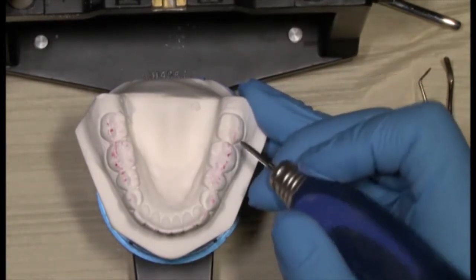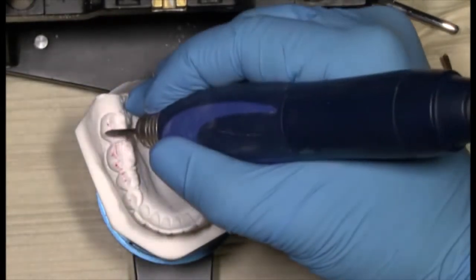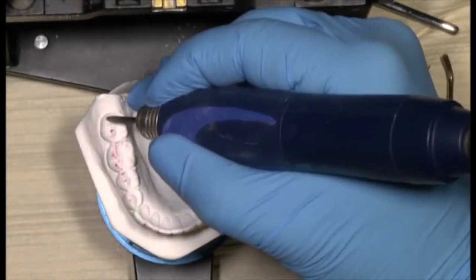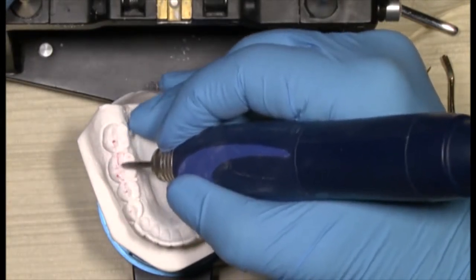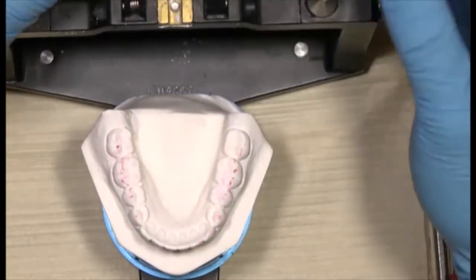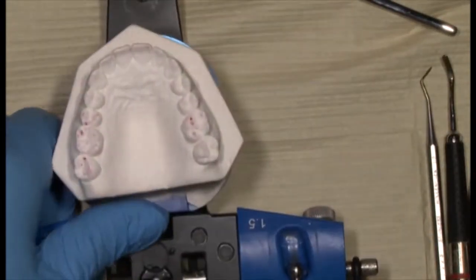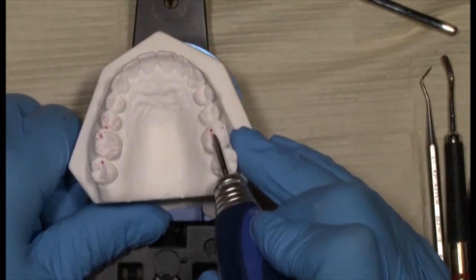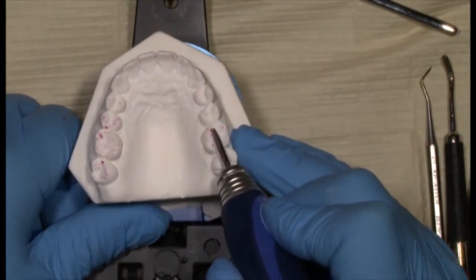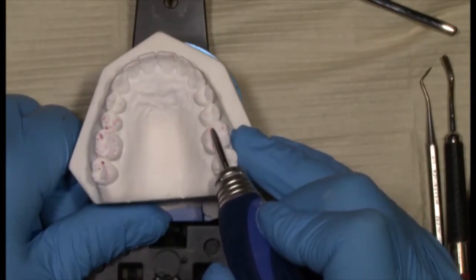So be careful, by the way, when you see marks with the articulating paper, you need to make sure that you can verify that they are real and not smudges. Remember the potential concerns with false positives and false negatives. So at this point, just so you get an idea of what we're trying to do, in the mouth, anything here and here is taken away because we're really wanting the contact to be on the cusp tip.